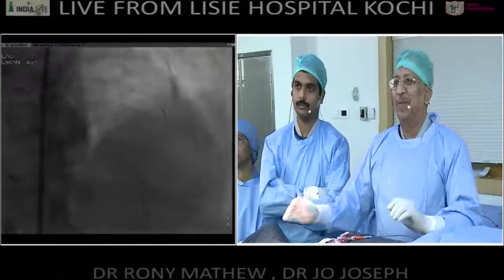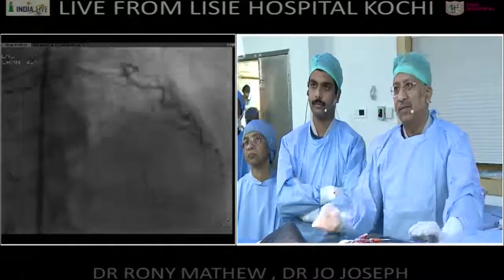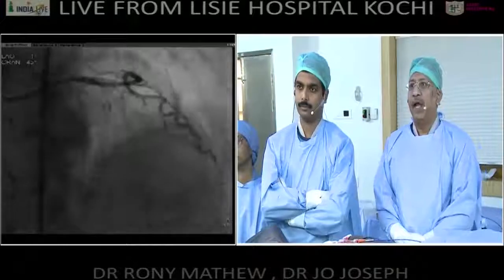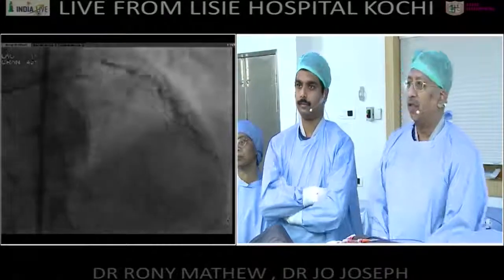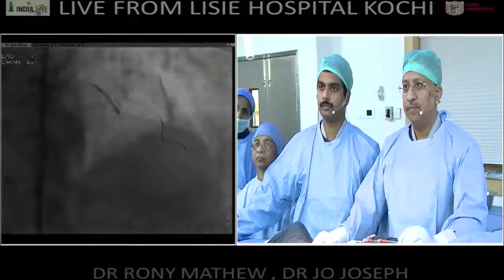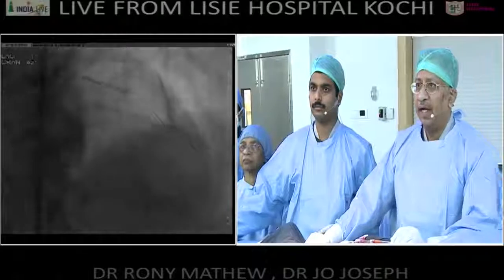Right. So what we did is we wired both the diagonal and the LAD, and we pre-dilated both of them. Show the next one. Good. And the next one.